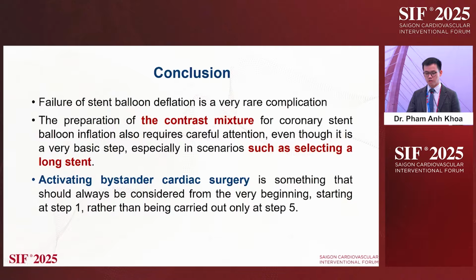The preparation of the contrast mixture for coronary stent balloon inflation also requires careful attention, even though it's a very basic step, especially in scenarios such as selecting a long stent. So after this case, when I use a long stent, I dilute the contrast properly. Activating standby cardiac surgery is something that should always be considered from the very beginning, starting at step 1, rather than being carried out only at step 5. Thank you very much for your attention.